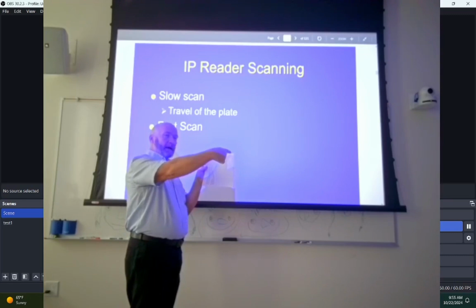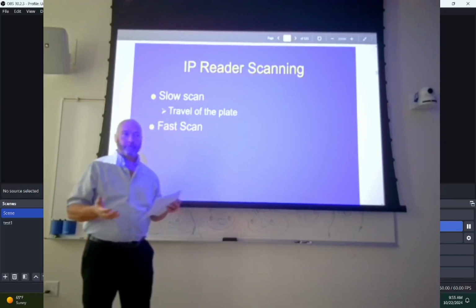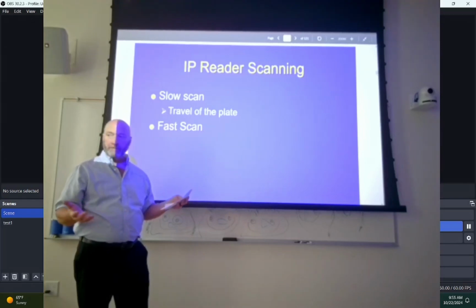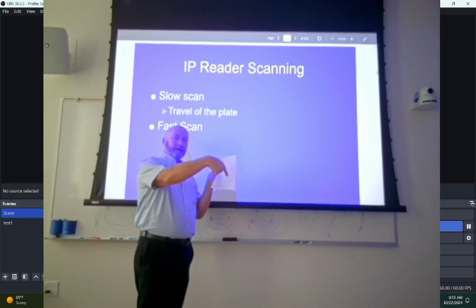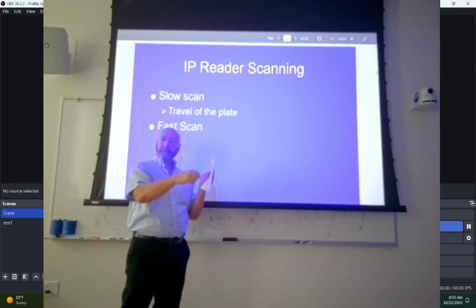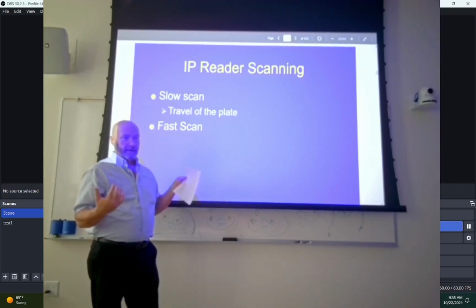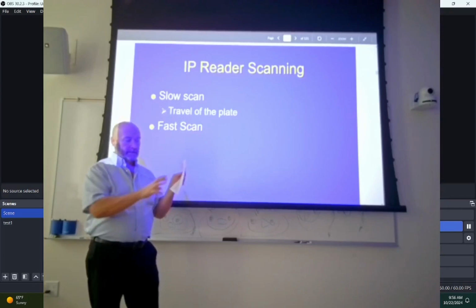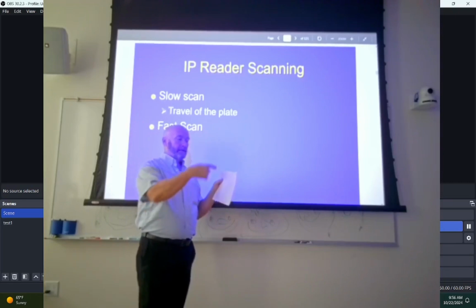So say I've got it situated right here. What happens to light as it travels? What does it do? We've got a word for it. The beam diverges, right? So what happens to the light here versus the light there? It diverges. So we have to have some focusing optics to make sure that it remains the same. Failure of those focusing optics, we lose sharpness of recorded detail, especially on the lower portion of the image receptor. Okay, so that's number one.